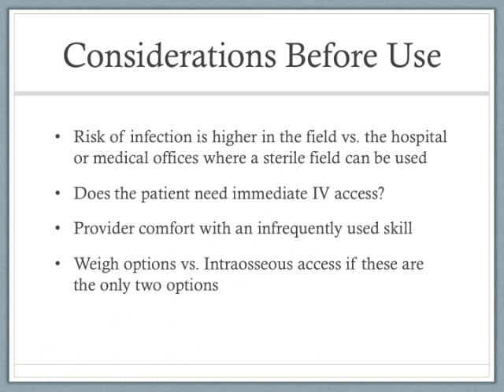Before accessing a central venous access port, you have to consider some of the other things out there. In the field, the risk of infection is much higher versus the hospital or in medical offices where sterile field and proper sterile technique can be used. You also should consider, does the patient need immediate IV access? Some providers also don't do this very often and may not be comfortable with the skill, or they may not be proficient in it as well. Each provider should weigh the options in each situation.